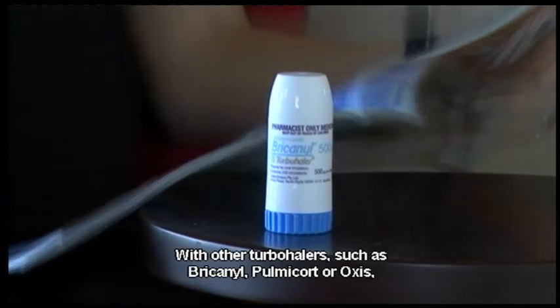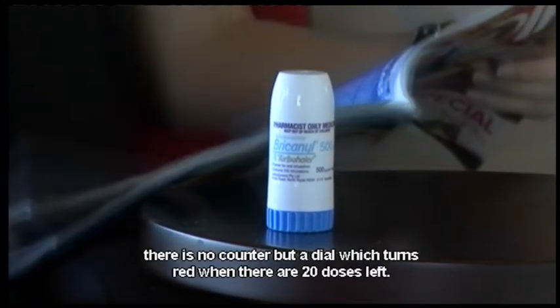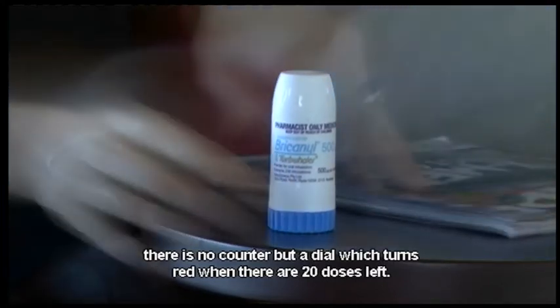With other turbuhalers, such as Bricanyl, Pulmacort, or Oxis, there is no counter, but a dial which turns red when there are 20 doses left.